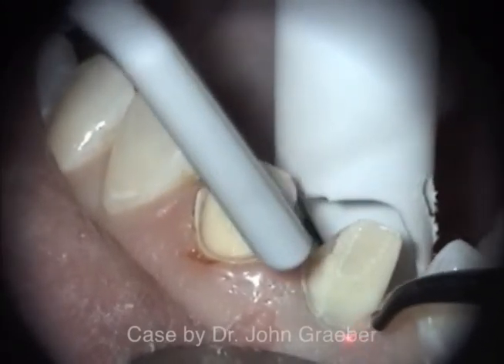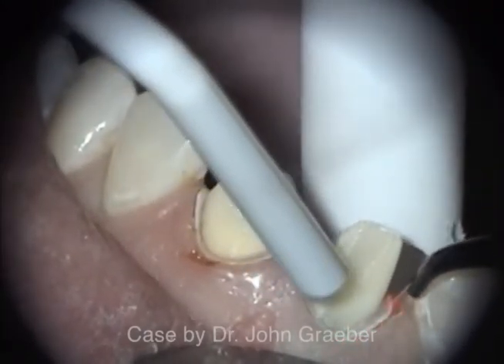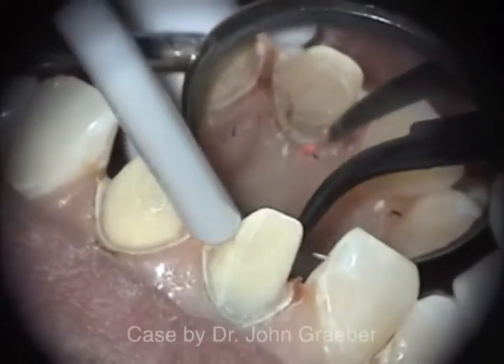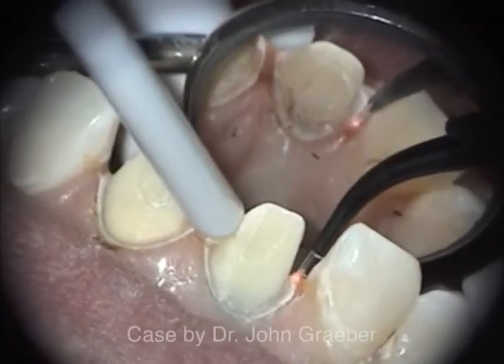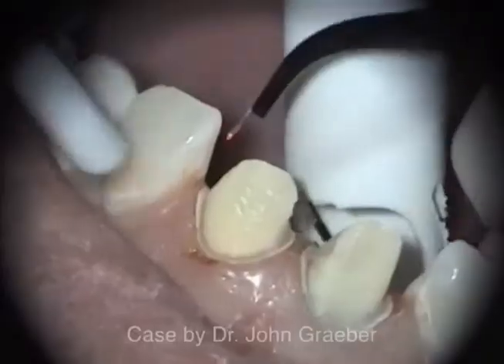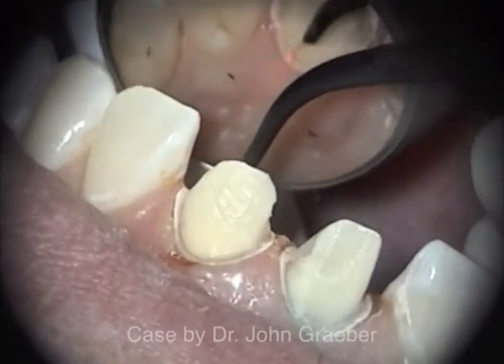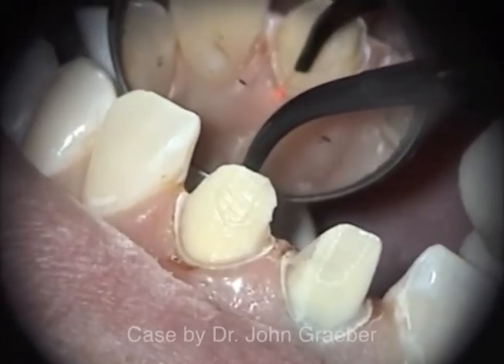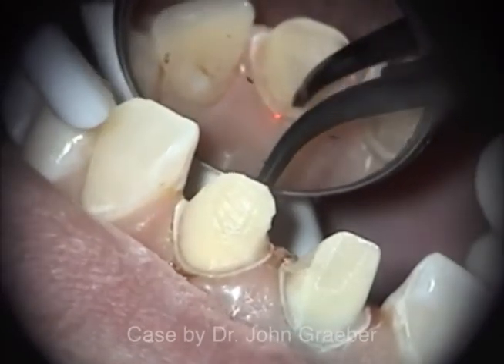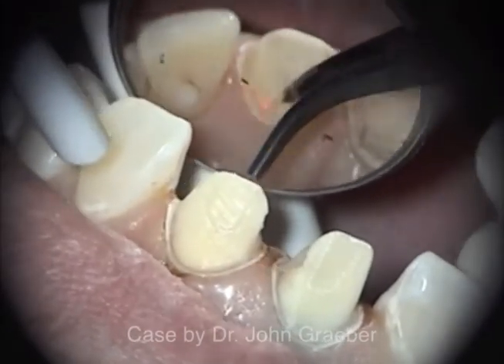Recession is minimized if there is no lateral blanching of the tissue while the laser is in active ablation mode. An air stream is used to provide additional external cooling during the active ablation or vaporization of gingival epithelium, while high speed evacuation is advised to minimize the slight odor of vaporization.